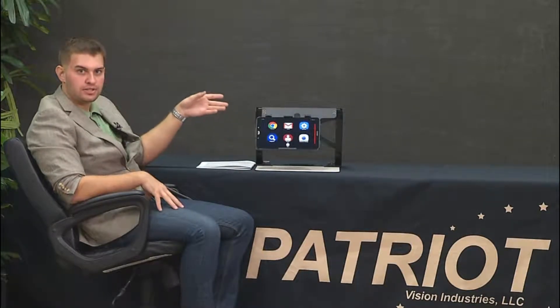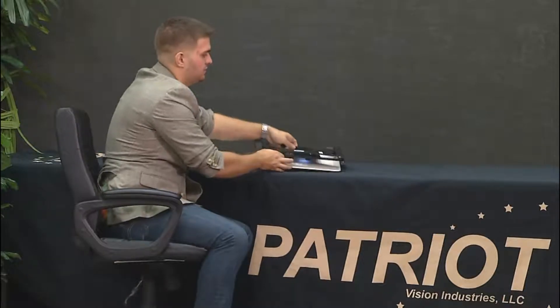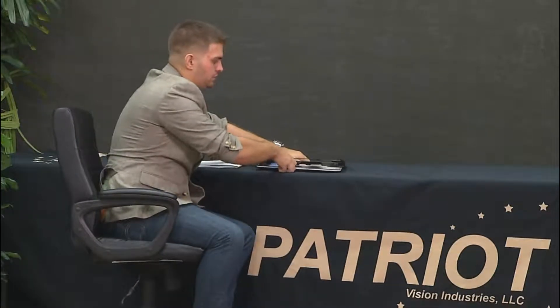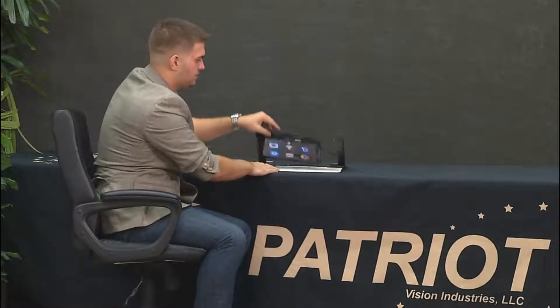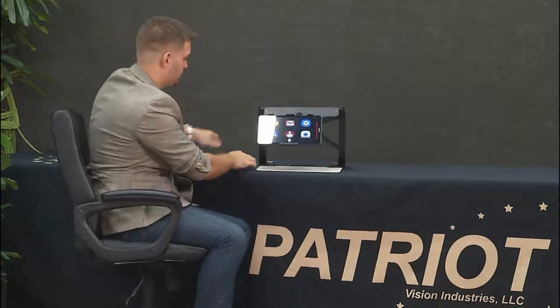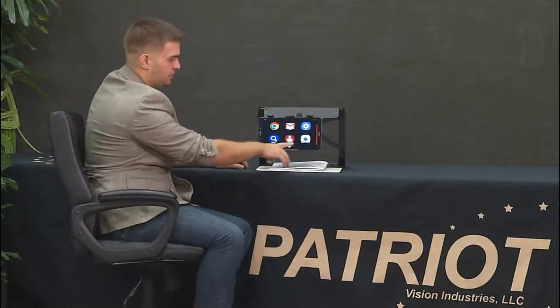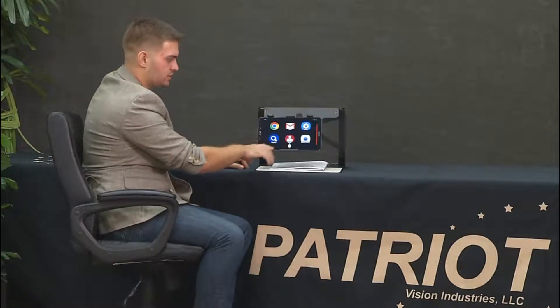It also can do distance viewing, so if you're maybe in a classroom type of setting and you want to look at a chalkboard across the room. It folds flat into a little carrying case and weighs under five pounds. When you place it onto the table, you can get the document underneath, and we have a bunch of different icons that are enlarged on the screen.